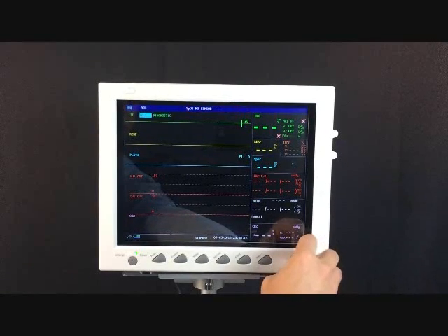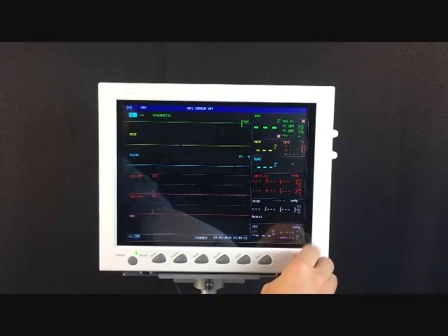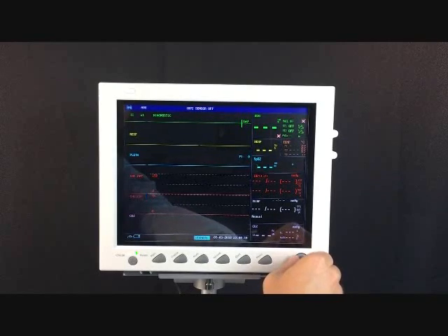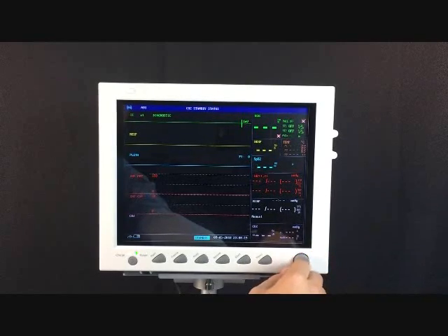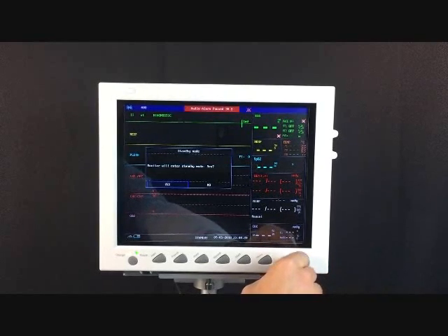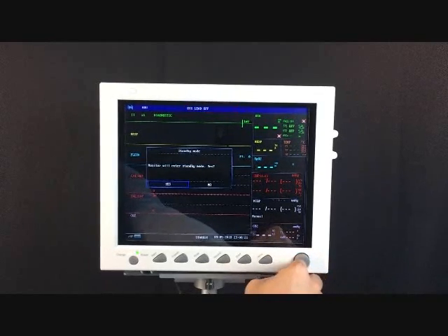You can also choose which waveforms you see from here. You can also put the monitor on standby mode.